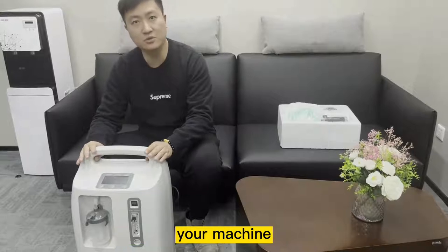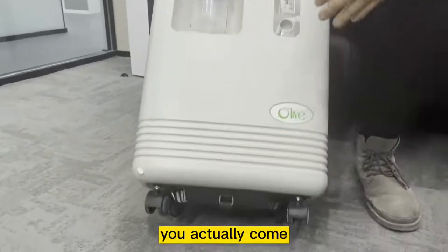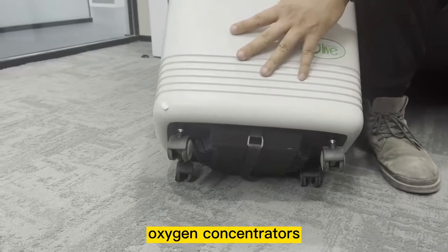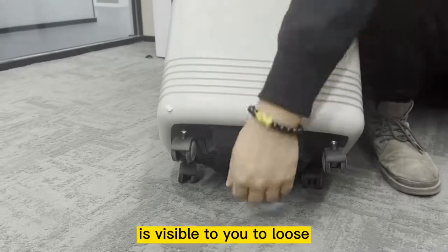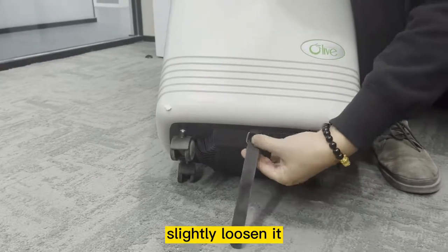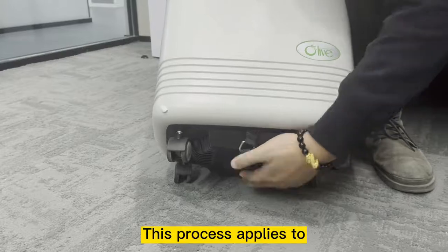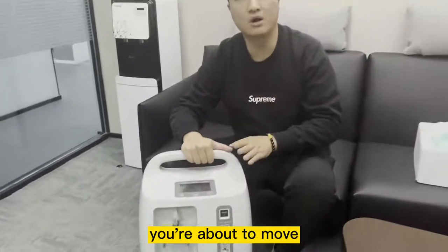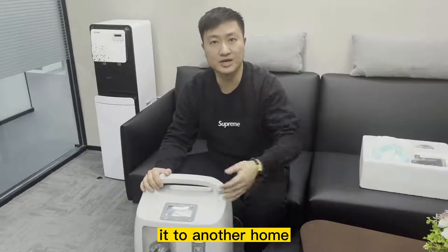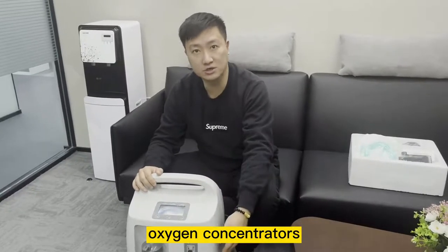When you first receive your machine and take it out, the first thing you need to do is look at the bottom of the Oxygen Concentrator — it comes with a black strap. This black strap is to hold the air compressor inside during transportation. While in use, it's advisable to slightly loosen the black strap. Whenever you are about to move the Oxygen Concentrator — for example, from one home to another — remember to strap on the black strap at the bottom during transportation.